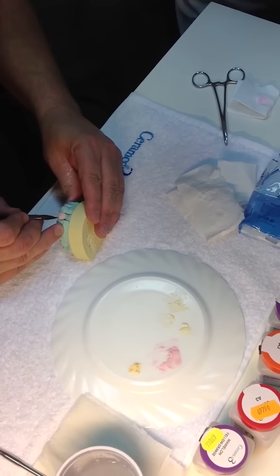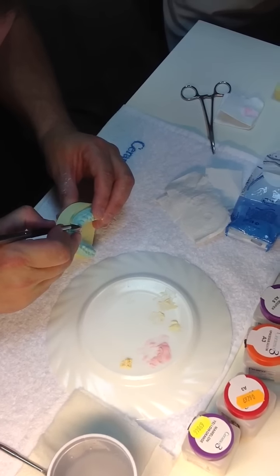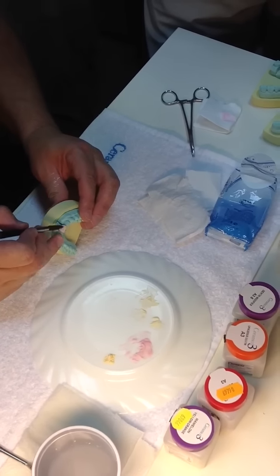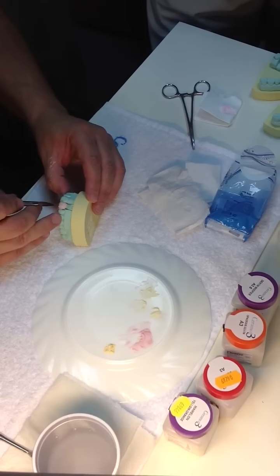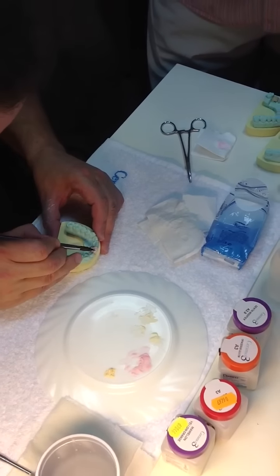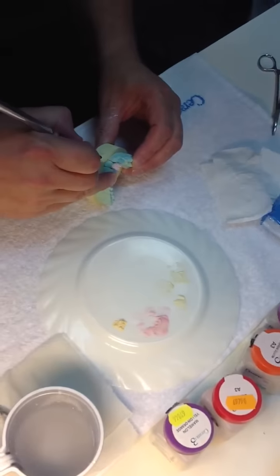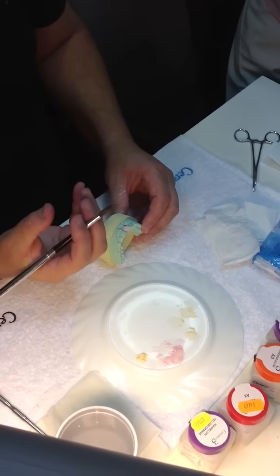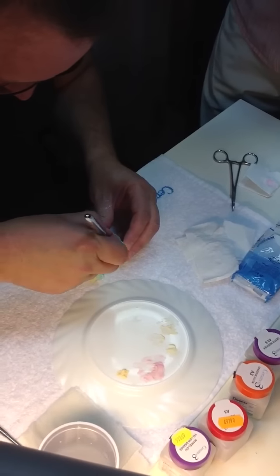I'm just cutting in some mamelon detail. With that opaque dentine lying underneath, if you cut in too deeply, you'll see the yellow coloration of the opaque dentine coming through. That'll be an indication that you're getting down too close.